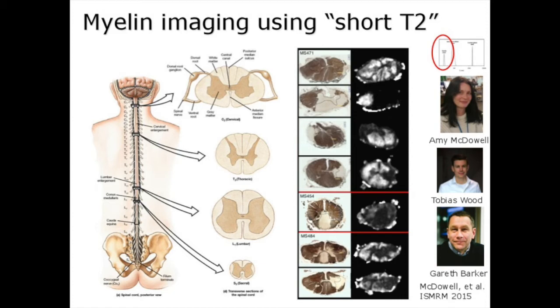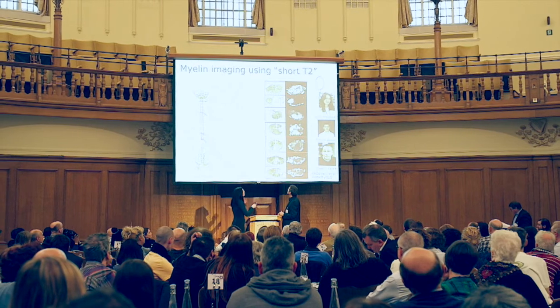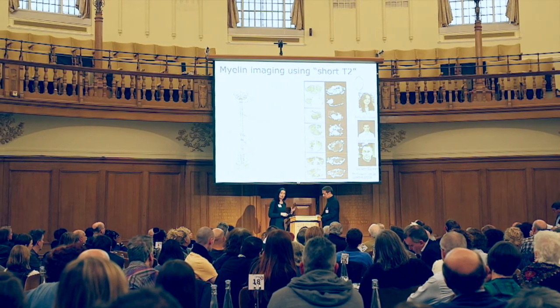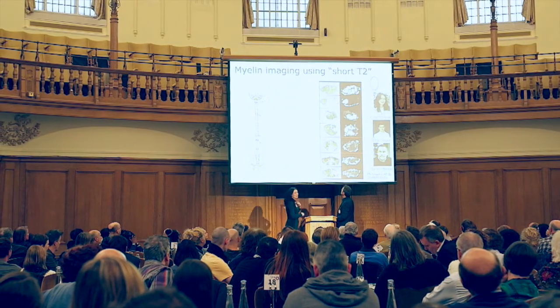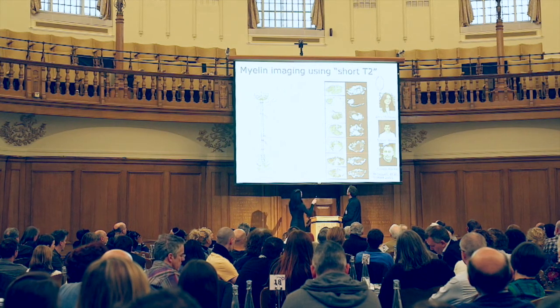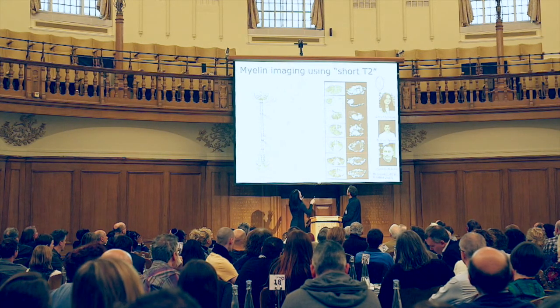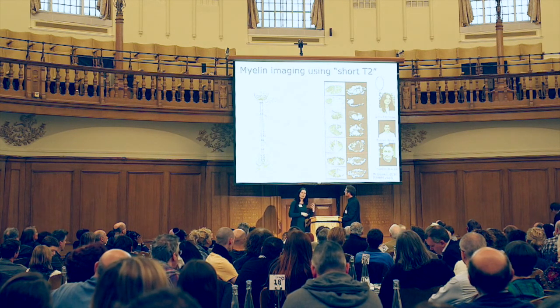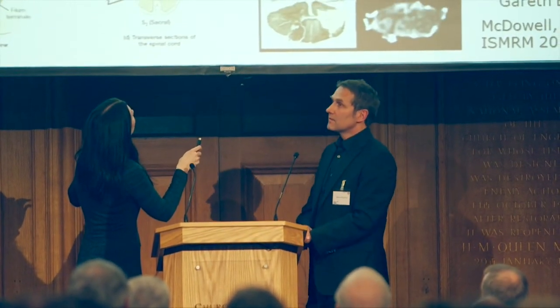So I first of all put this in my MRI scanner, and I took some images, and after a lot of computing processing, I made some myelin maps. Now, in order to make sure that what I was looking at was actually true and real, I gave them to my histopathologists, Natalia and Daniele, thank you very much, and they sliced it just like a salami, put these slices under a microscope and stained them for myelin. So brown is where the myelin is, white is where the myelin is not.